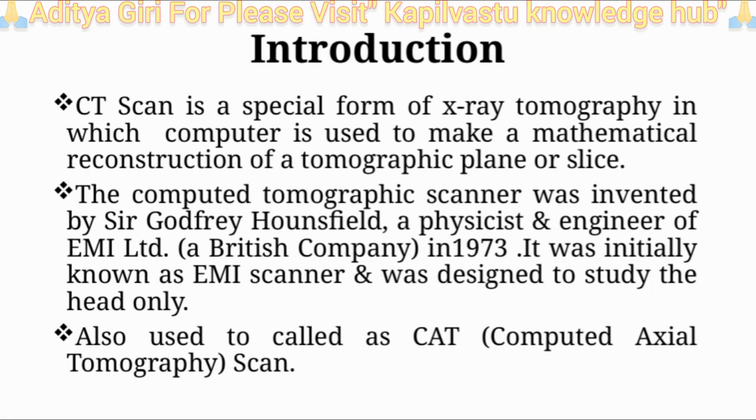Today, I want to talk about CT scans, which are a special type of X-ray tomography. Unlike regular X-rays, CT scans use a computer to create a detailed mathematical reconstruction of a specific plane or slice of the body. This allows us to see cross-sectional images with much greater detail.